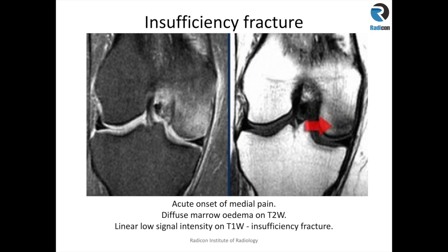The patient may have stress-inducing activity that brings on the pain suddenly, or inability to weight bear might be the presenting complaint. On STIR or water-sensitive sequences you get marrow edema within the area of interest, and on a corresponding T1 sequence you may see a thin linear low signal intensity running through that area of marrow edema, suggesting a trabecular microfracture or non-displaced fracture. This is the classical appearance of a stress or insufficiency fracture.